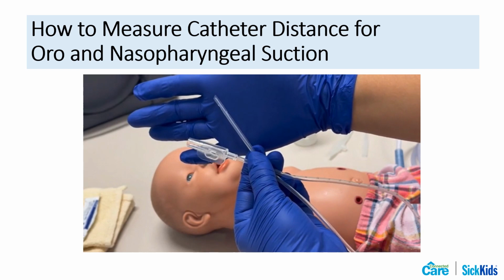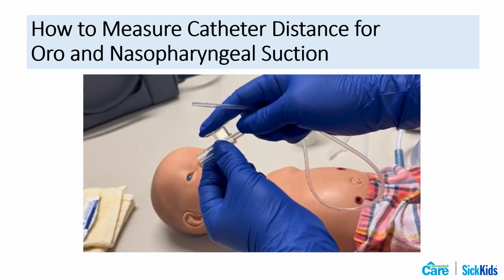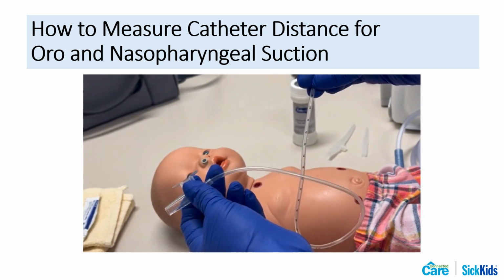Note that there are 2 holes on the side of the suction catheter and 1 at the tip of the catheter. You will need to hold your thumb over the suction control port to apply suction.